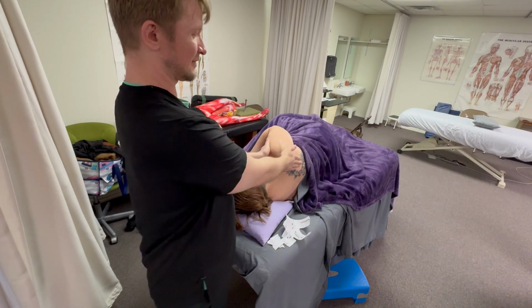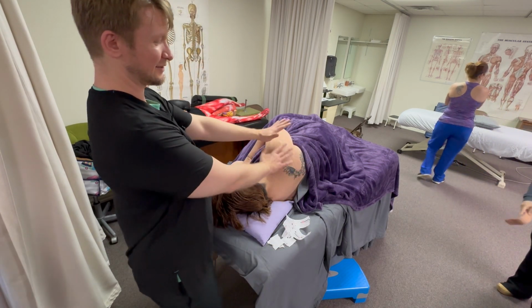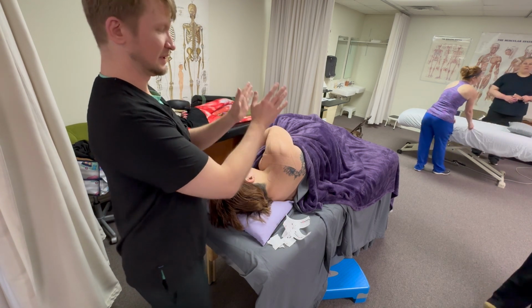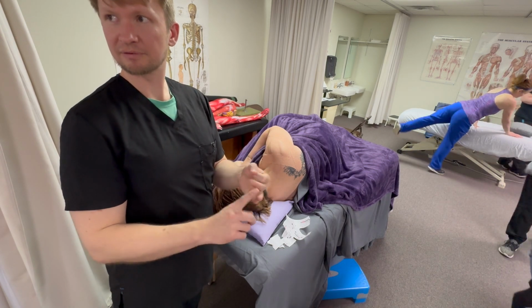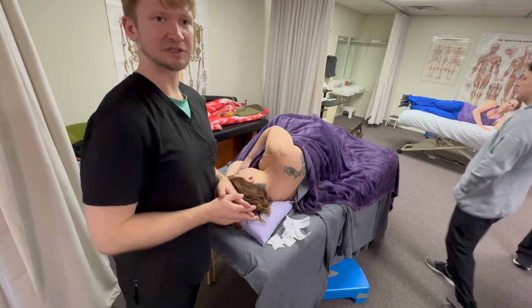Go ahead and try. That's the shoulder, plus the bicep. But that's it. There isn't a whole lot more you can do for the shoulder joint than this. So, doesn't matter what the shoulder problem is, rotator cuff, osteoarthritis, bursitis, anything. This is a good starting point to just see if it helps.